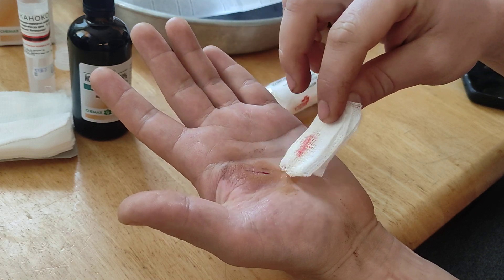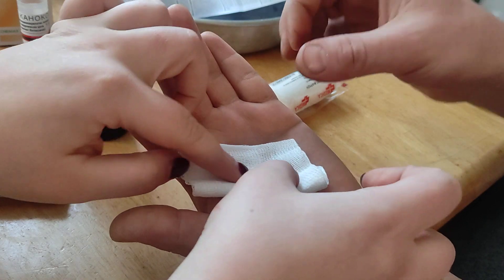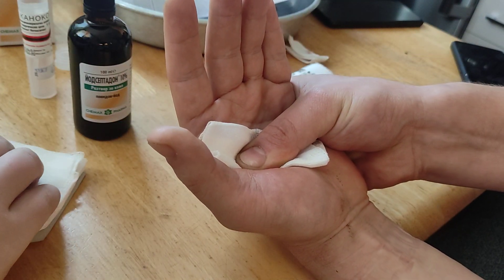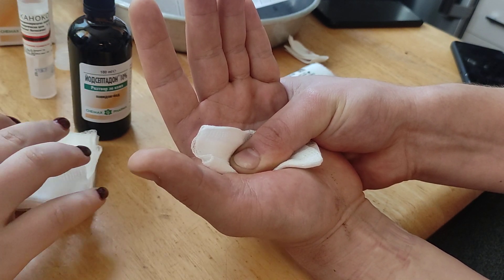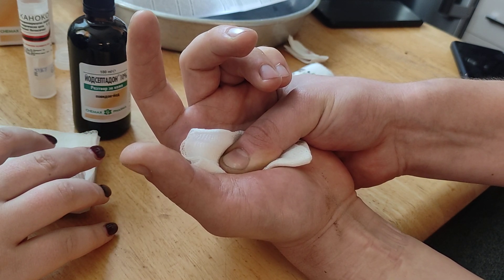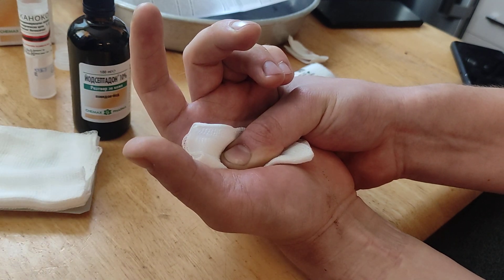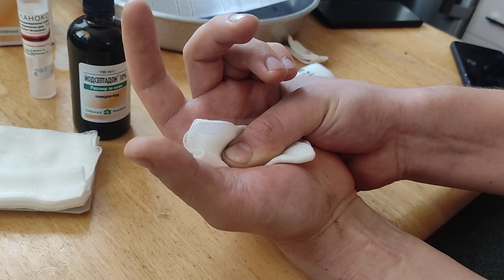It needs to be dry, like it is now. It keeps on bleeding — that's bad. We'll wait a little bit. It should not bleed. As you saw it bleeding, it should not bleed. So I'll grab something cold now and continue, because if it's bleeding, it's not going to be able to stick, and I'll lift my hands above my head.